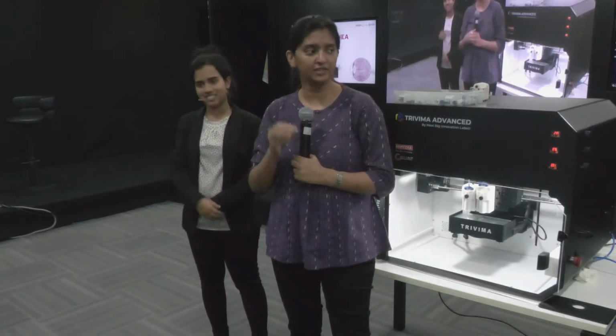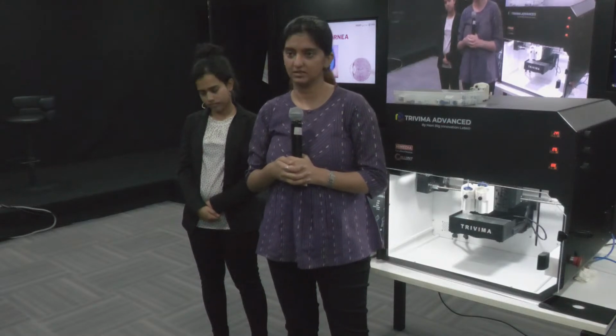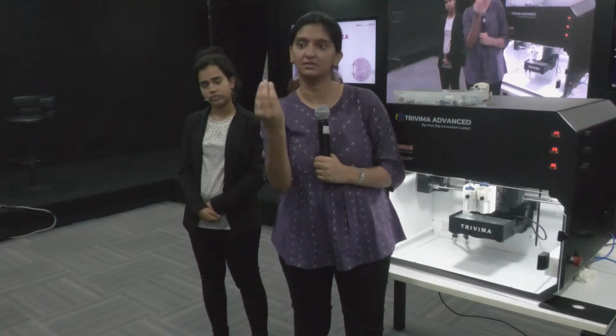The nutrients, the growth factors, the matrix, everything has to be incorporated in the bioink itself. In cell culture, they used to use that kind of matrix and then put hepatocytes into it. Yes, and then that matrix will be the bioink, which comprises what you're going to fabricate.